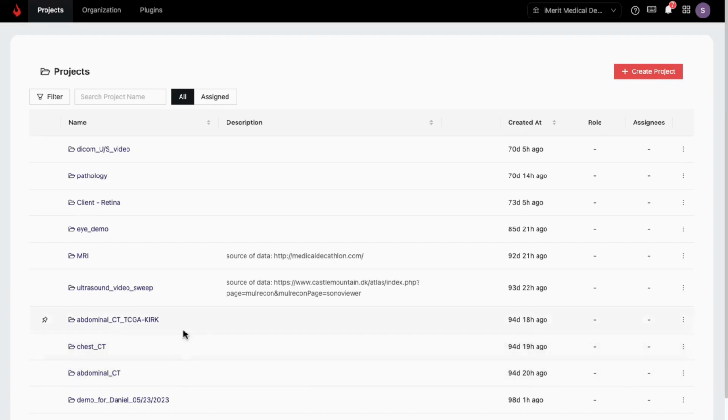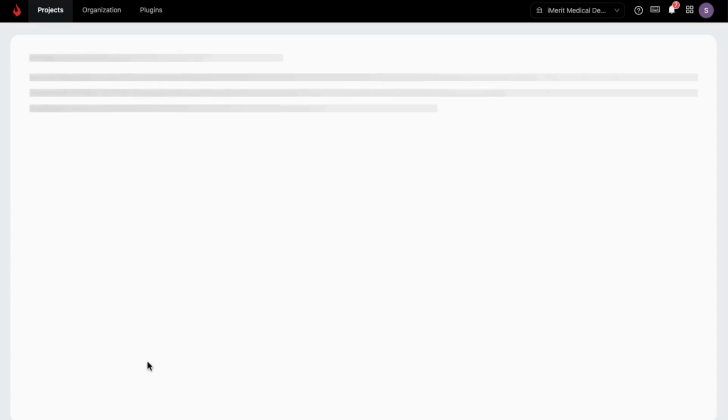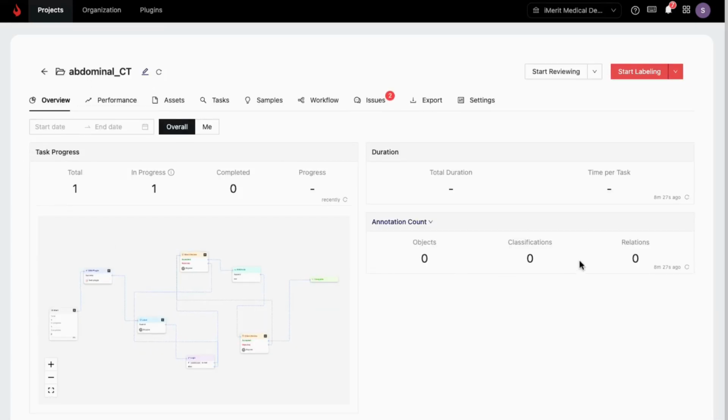We really liked some of the functionality that existed in the open source space with tools such as Slicer. But we needed to marry that to the people and the data management that was necessary to scale projects to the amount needed really to drive large amounts of data.